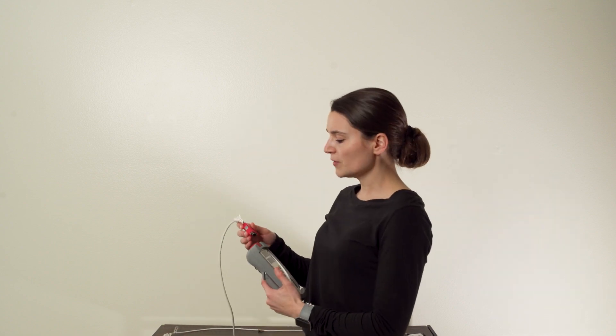First, you'll grab the pulse oximeter, then plug the cord directly into the top.